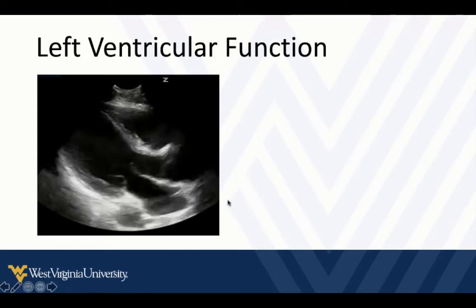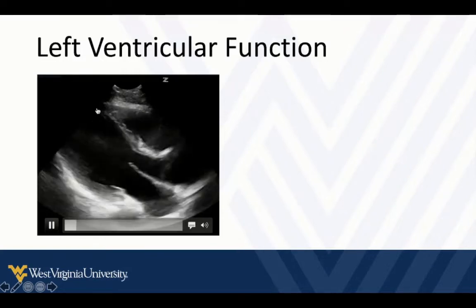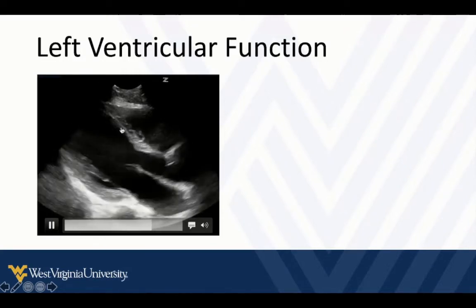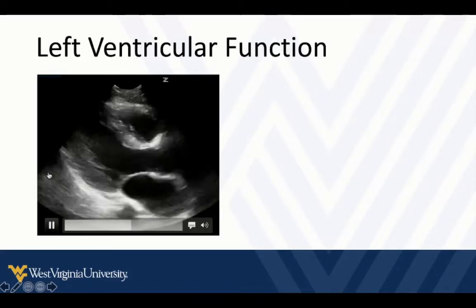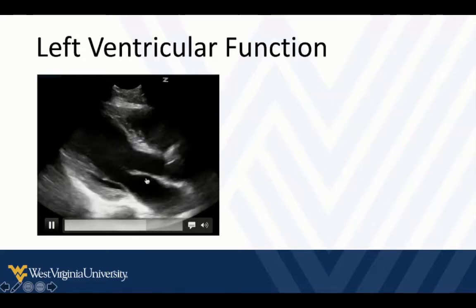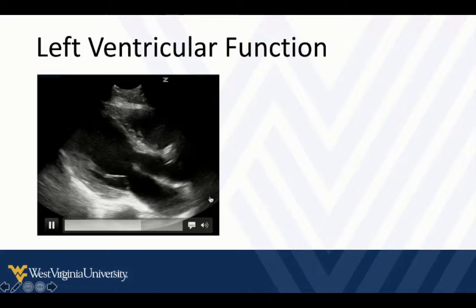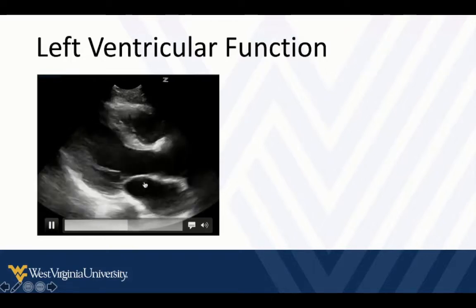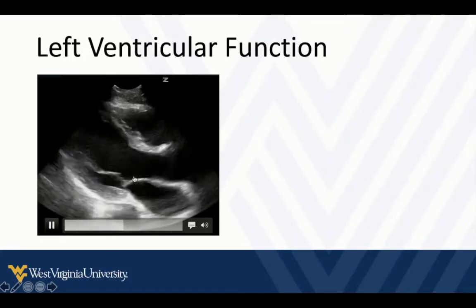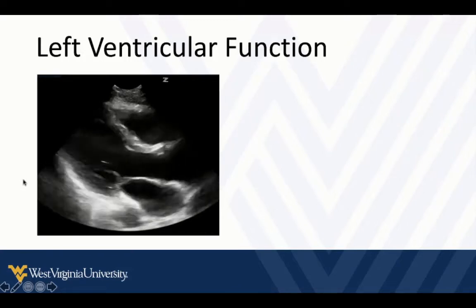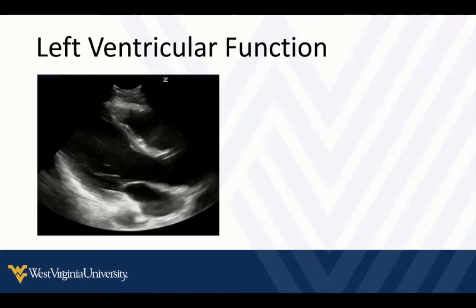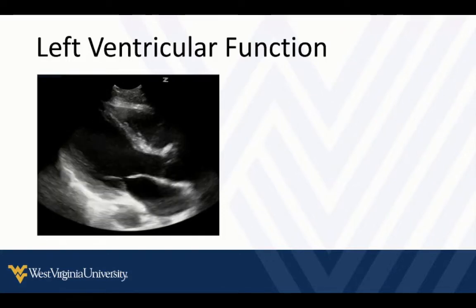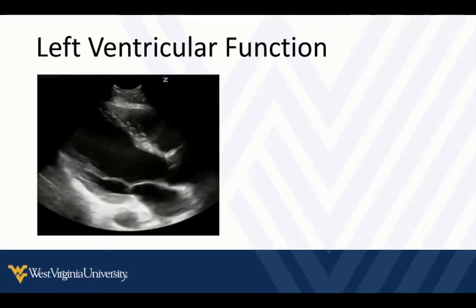Here's a nice parasternal long axis view. You want to start practicing and training your eyes to recognize the thickening of the walls — that's the contraction, that's how the walls thicken — and how much the volume changes during systole throughout the cardiac cycle. The mitral valve gives you a lot of clues. When there's lots of fluid transfer, that causes the mitral valve to open up nice and wide, and during early filling it pretty much slaps up against the septum. If you see that mitral valve opening nicely and slapping up against the septum, they probably have normal left ventricular systolic function. Still want to correlate and look at the rest of the picture, but that's a pretty good indicator of normal function.